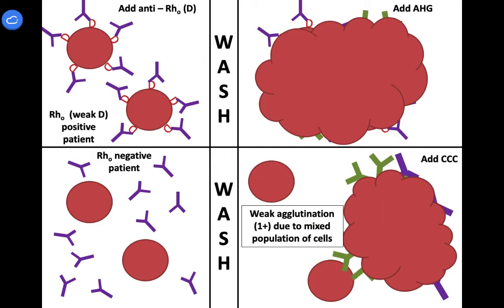This is a complicated thing. Okay, this is a super complicated thing. If your brain is like, I have no idea what's going on, talk it over out loud. Let me know how I can help. It's going to be important that you have a solid understanding of this. And if it's not right now, that's okay, because we're going to move into this topic in class so we can really discuss it. But please note that if you're feeling like, what is going on here? It's worth stopping, reading, asking questions.